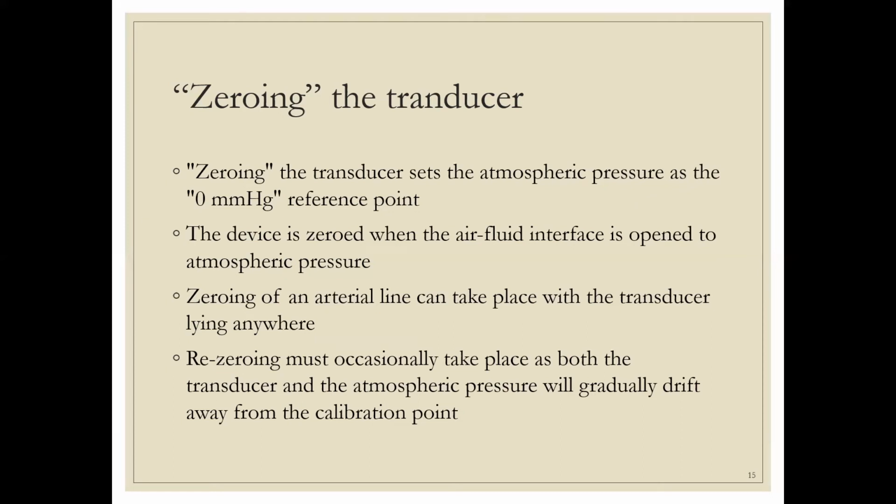So that is known as opening to air. What happens is, when we open it to air, saline from the pressurized saline bag will flow through the transducer to the port which is open to air, and then an air-fluid interface will be formed. At this air-fluid interface, the pressure offered by the atmosphere is equivalent to atmospheric pressure. Once this is opened, when we press the button set 0, or do zeroing, the device will calculate the atmospheric pressure and take it as 0. So this is known as zeroing the transducer. Making the transducer understand what atmospheric pressure is, is known as zeroing.